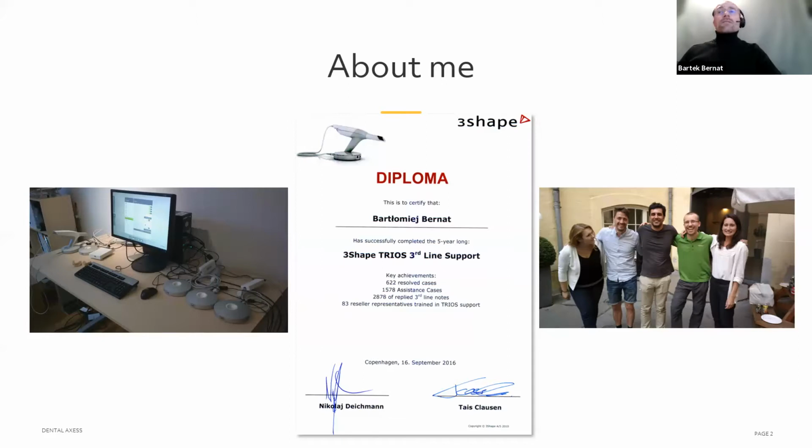So as you can see on the screen, there are some history photos with my team and also some very old pods for TRIOS 2. As I started, TRIOS was just at the very beginning. It did not even have a name, TRIOS 1, just TRIOS.